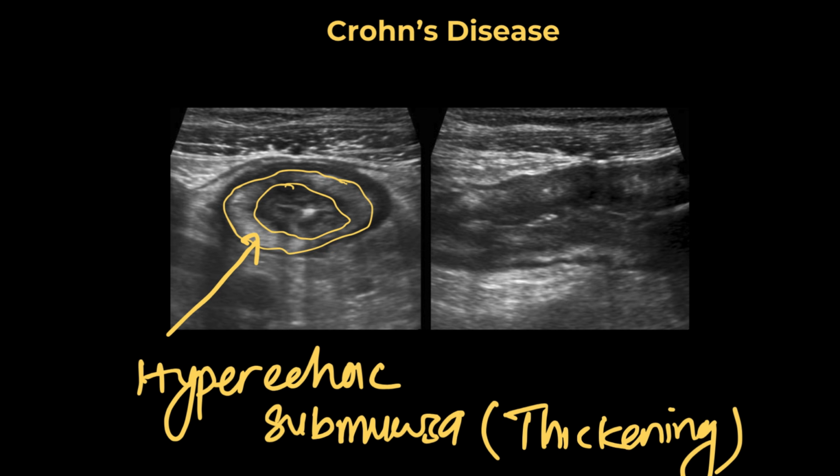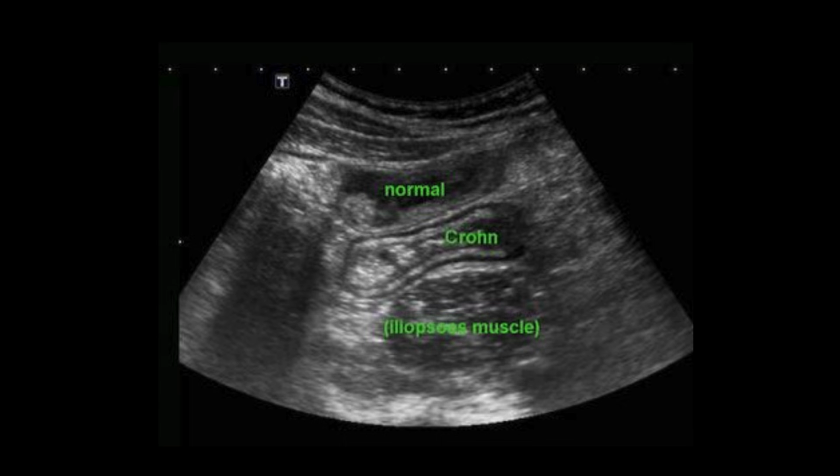One of the features of Crohn's disease is the patchy way it affects bowel. This results in skip lesions, where large parts of the bowel are left unharmed. The affected parts show a relatively sharp demarcation, the transition from normal to abnormal being rather abrupt. Bowel diameter is usually narrowed. This is due to stenosis or stricture formation. You may see dilation of bowel before the narrowed segment, especially if there is partial obstruction. Peristalsis is reduced or absent in the affected segments. The bowel becomes rigid and stiff.